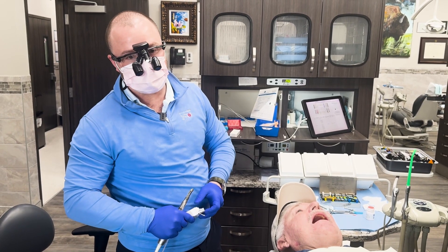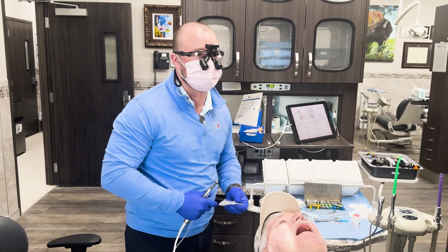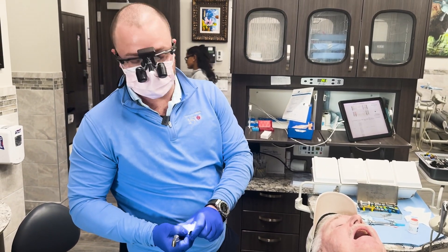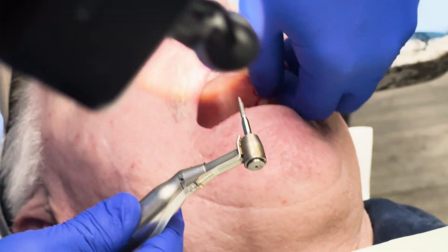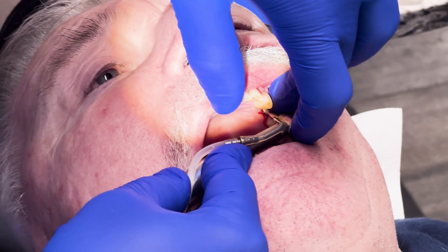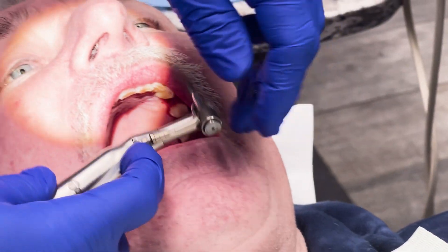There's going to be a beep at 30 and 60. And if there's not a beep at 30 and 60 but it still feels solid, I'll show you how I can test that. If I still feel like it's a nice solid implant, I'll still be able to load that and we'll just give it a little longer time to heal — let that bone heal around the implant. What I do with the implant is push it down until I'm in the bone. There's going to be a little bit of thread still out of complete bone, but if we can get at least 75% of these threads into bone, we should be in a good spot.